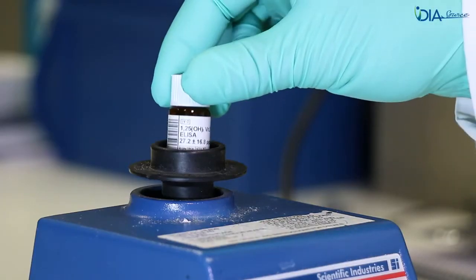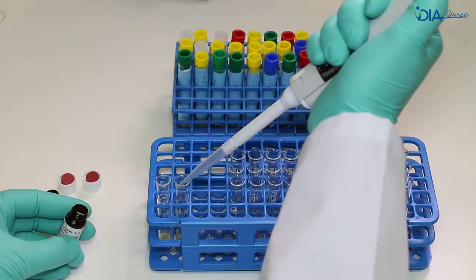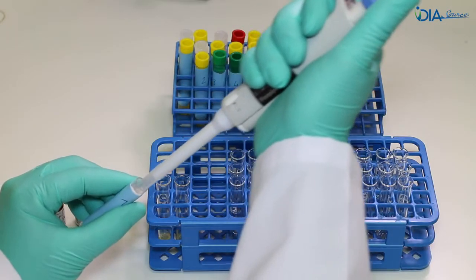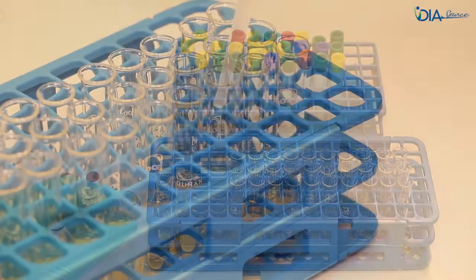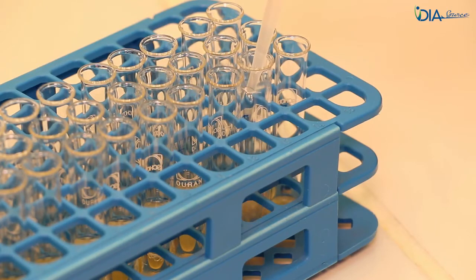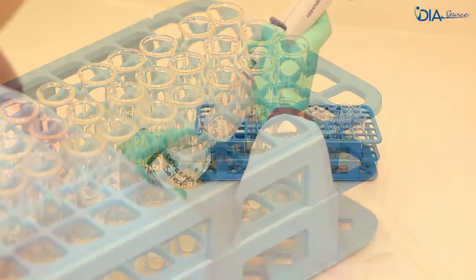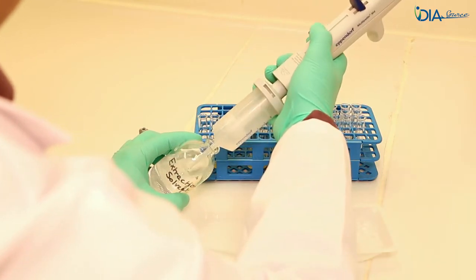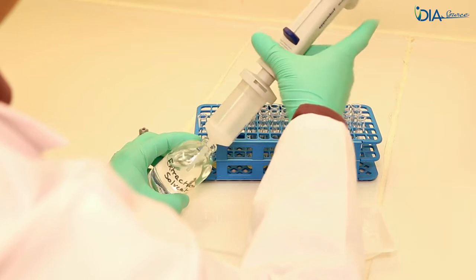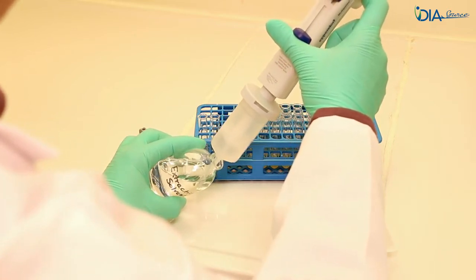Vortex the controls and the patient samples. In the extraction glass tubes, pipette 500 microlitres of patient sample or control and add 2 millilitres of the extraction solution. As the extraction solution is composed of organic solvents, the pipette tip must be pre-saturated two or three times with the solution to ensure an accurate volume.